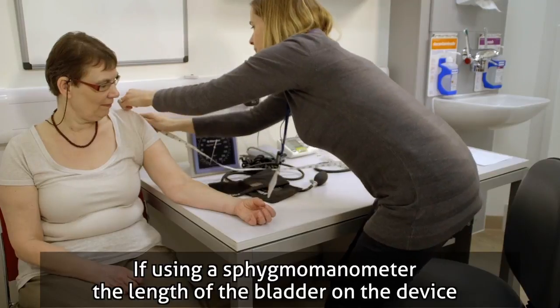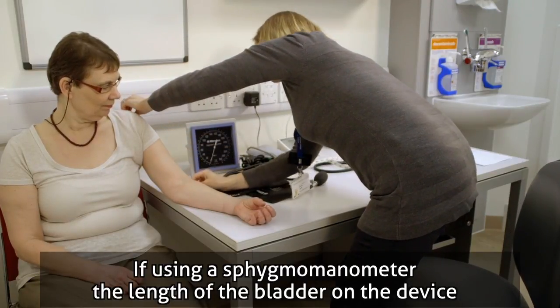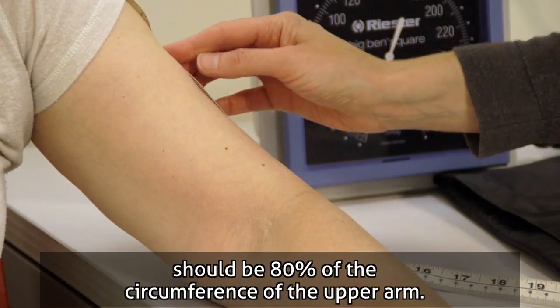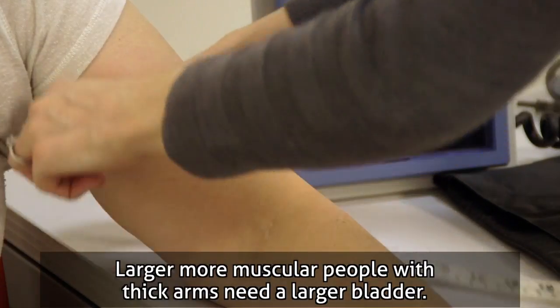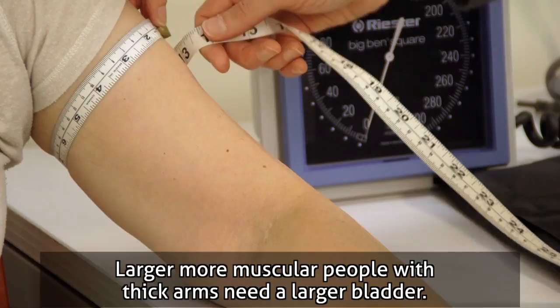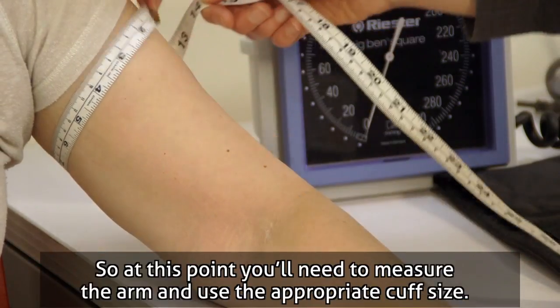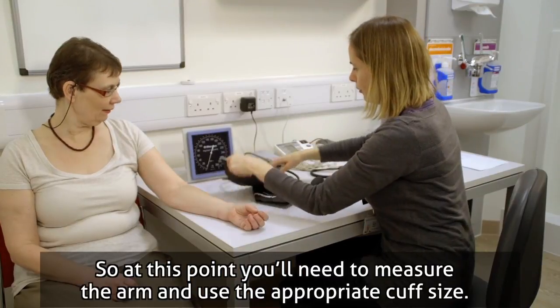If using a sphygmomanometer, the length of the bladder on the device should be 80% of the circumference of the upper arm. Larger, more muscular people with thick arms need a larger bladder, so at this point you'll need to measure the arm and use the appropriate cuff size.